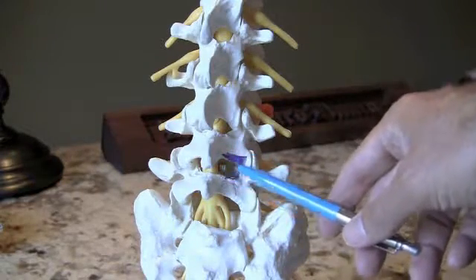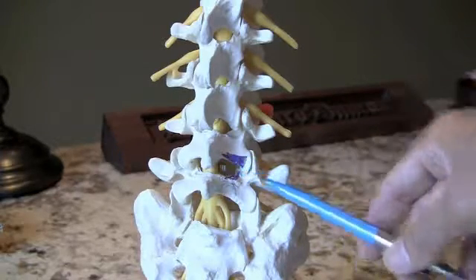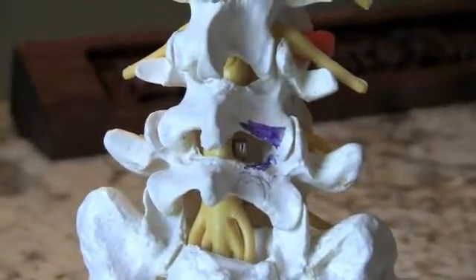You can see here between the 4th and 5th vertebra on the left side, we would take away a small area of bone that's shaded in purple there. It ends up being about the size of a dime, and that's called the laminotomy site.